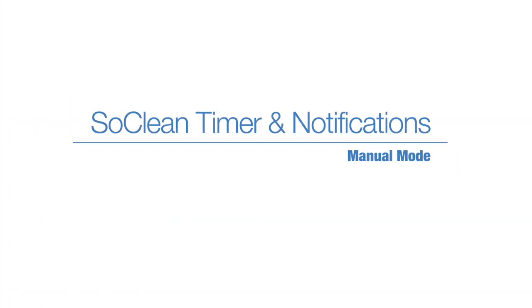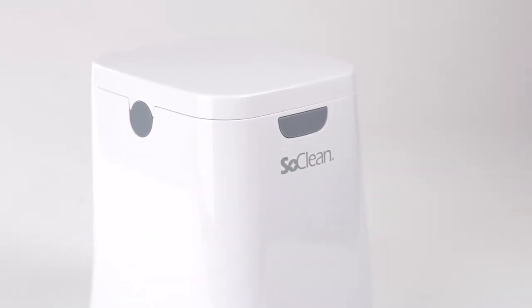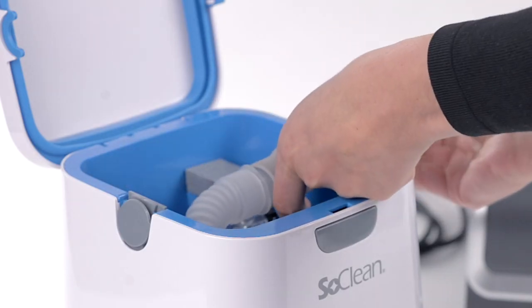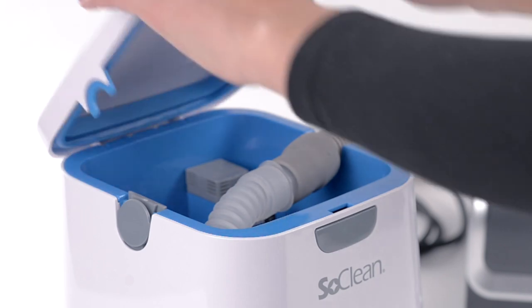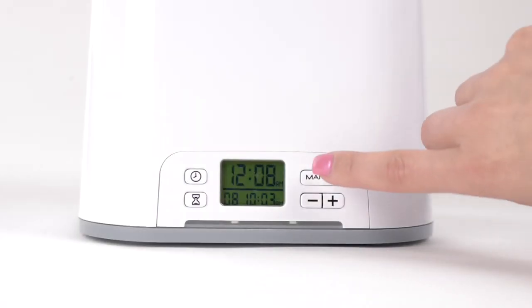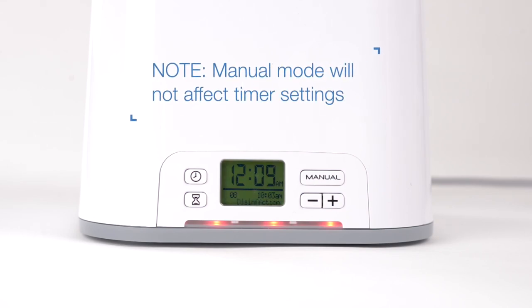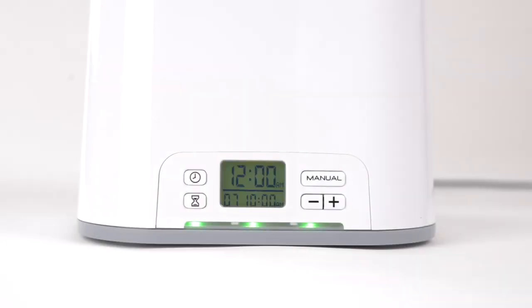Manual mode: when you wish to run the SoClean other than during your scheduled cycle start time, make sure your sleep equipment is in place and the SoClean lid is closed, then press the manual button to begin the cycle. The cycle starts immediately and runs for the set cycle time duration, and will not affect your pre-scheduled start time. As usual, wait for the green light before removing your equipment.